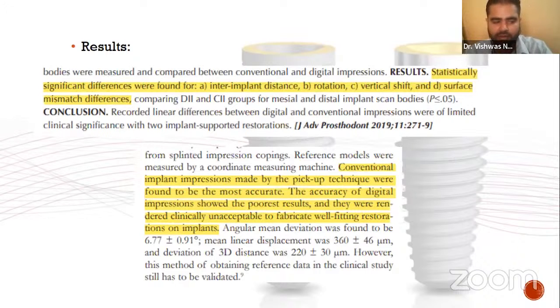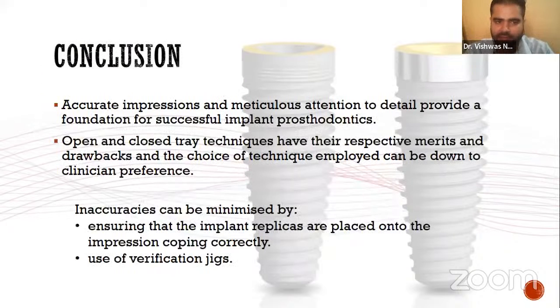So although we are on the path to digital dentistry, there are still some limitations in using digital pathways. Finally, I would like to conclude that accurate impressions and meticulous attention to detail provide the foundation for successful implant prosthodontics.